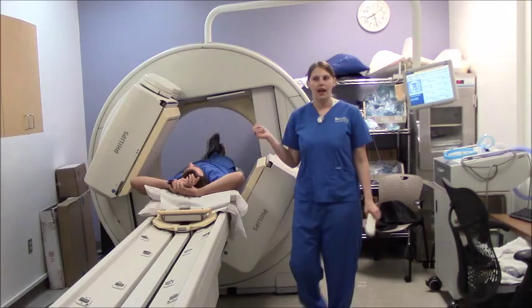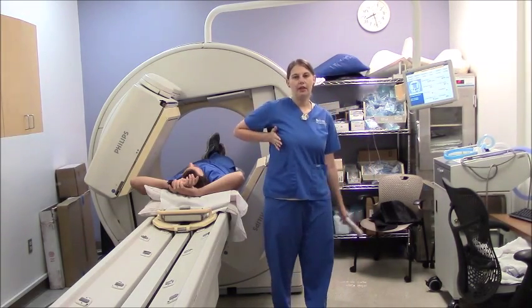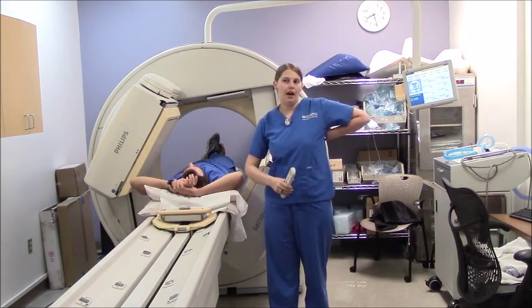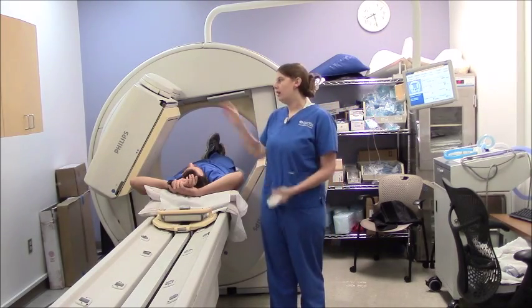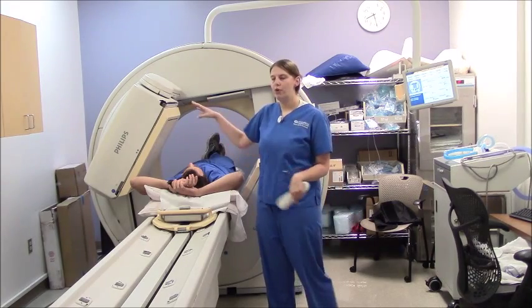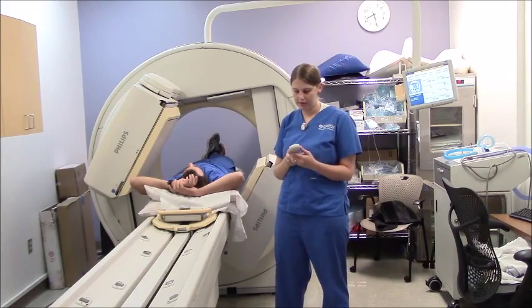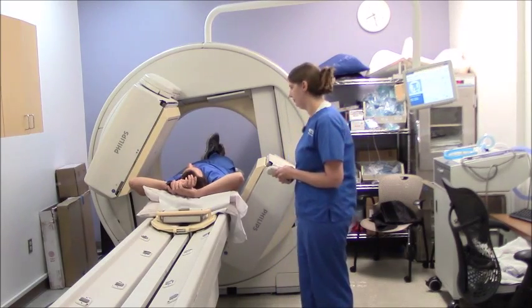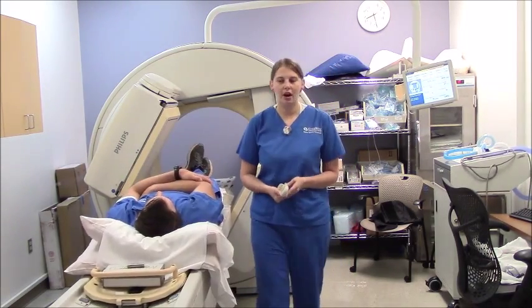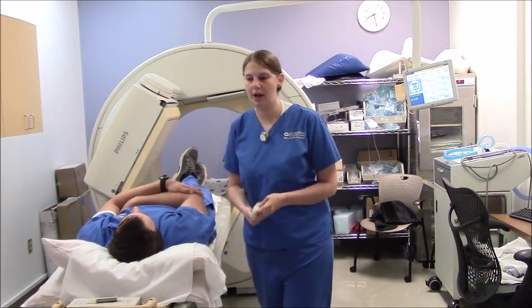And this would be our last view, taking an oblique picture of the front of the other lung and of the back of the other lung that we missed. We would again bring the heads in close, take our image, move them out, and then we're done. So now I'll pull my patient out. Let them relax their arms as soon as they can. They're often sore from holding them up that long.